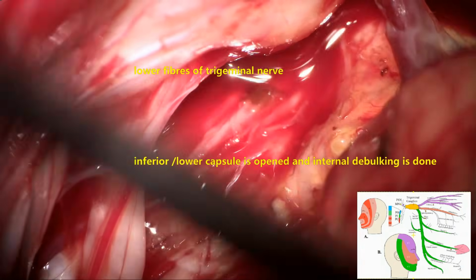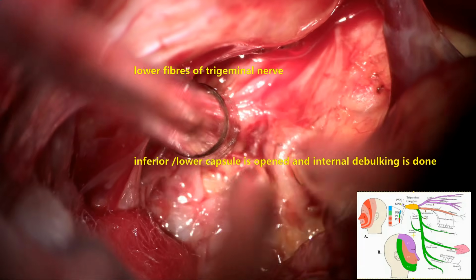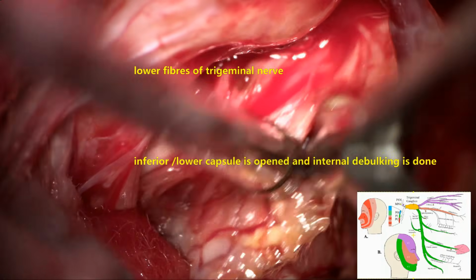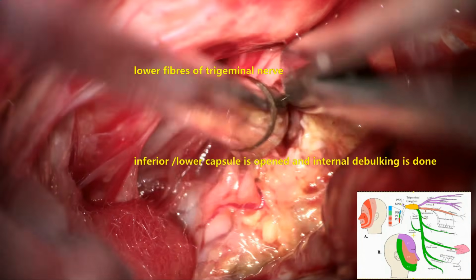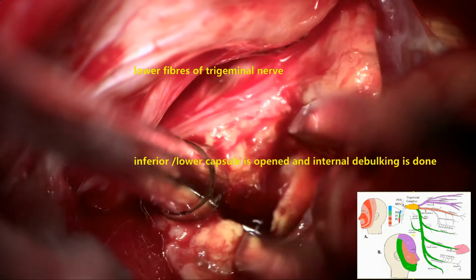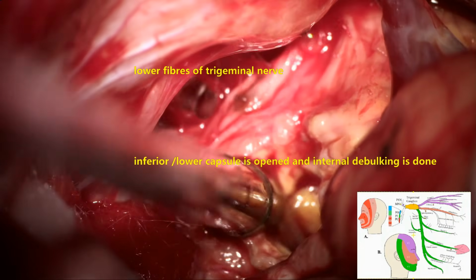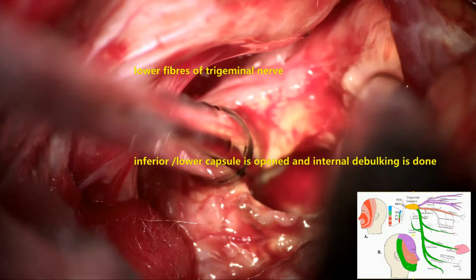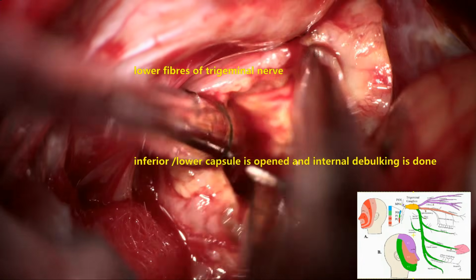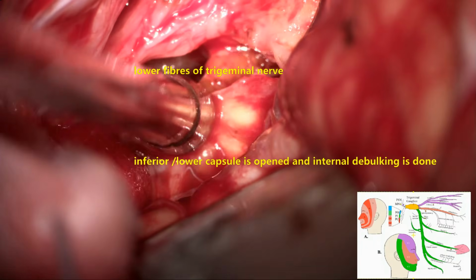Now I want you to see on the surface of the tumor, you are seeing the nerve fibers coursing, which are inseparably fused with the tumor. These are the nerve fibers giving origin to the tumor. Inferior part, probably the lower rootlets of the trigeminal nerve, sensory rootlets originating from the medulla oblongata and upper cervical spinal cord, predominantly sensory fibers. Now, these fibers we try to separate and preserve as much as possible.